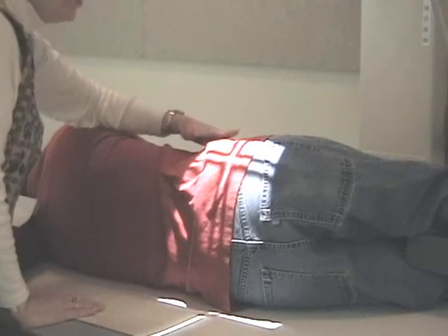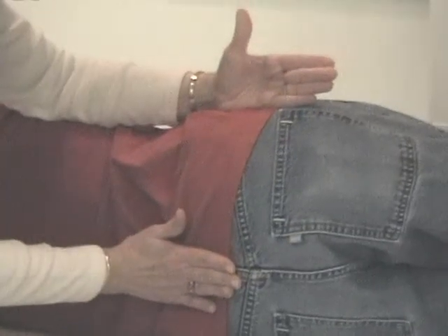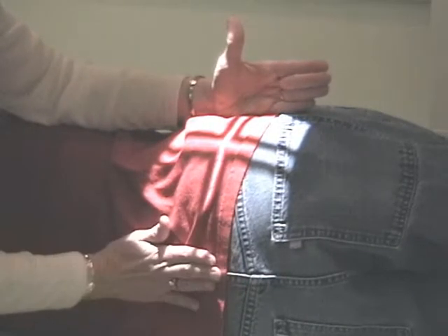Okay, again, here's the trochanter. L5 is just behind it, or you could use the 2 inches behind the ASIS. Find where L5 is. That's the very anterior portion of the sacrum. You can feel or palpate the posterior aspect of the sacrum, and this crosshair should come right down between those. And I think the camera can see that relationship there.